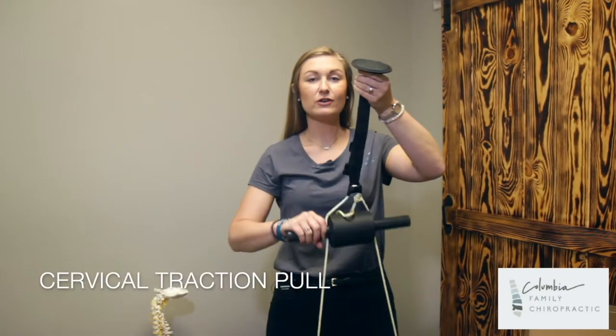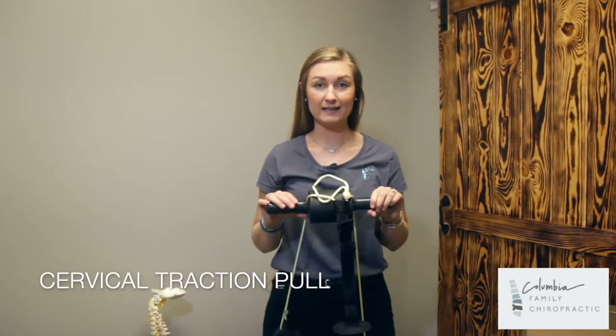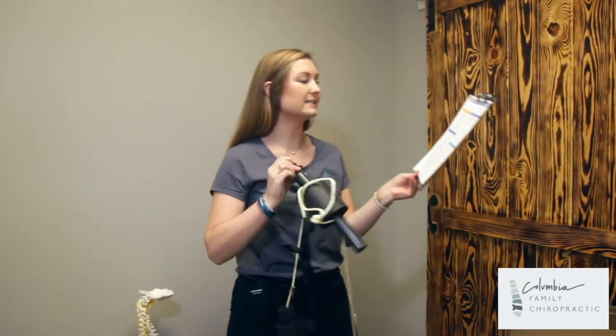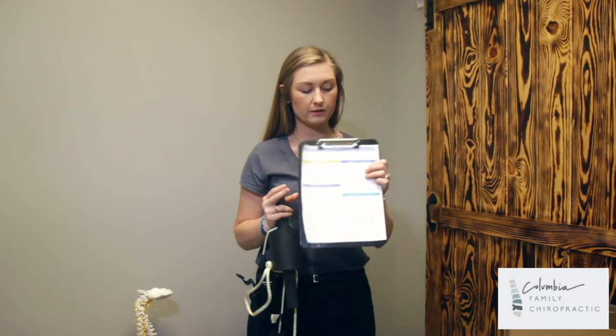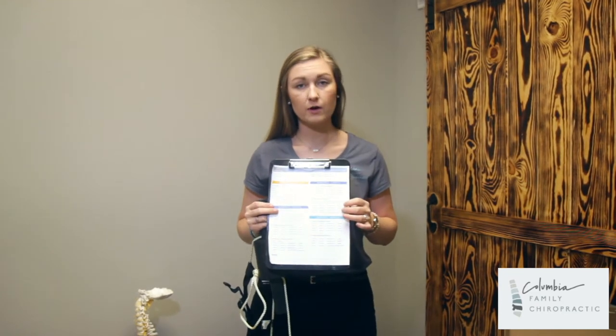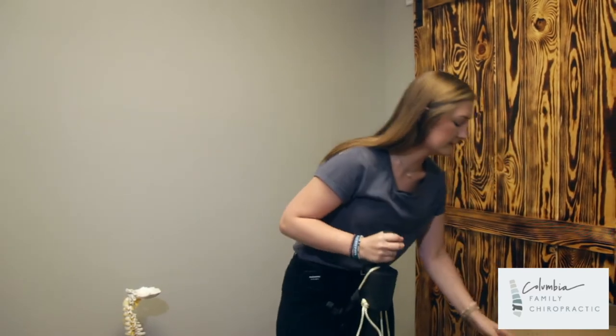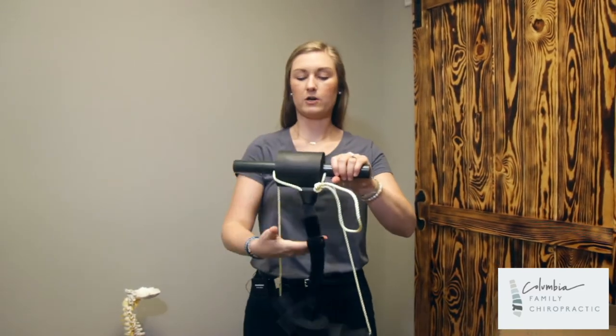For this exercise we are going to be using the cervical traction unit again, but this time it is cervical traction pull instead of standing cervical traction. On your sheet, on the right hand side of the front page, there are going to be a couple of different options we can do for this. First, I want to show you the placement.